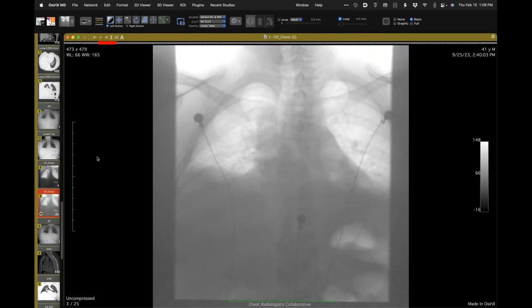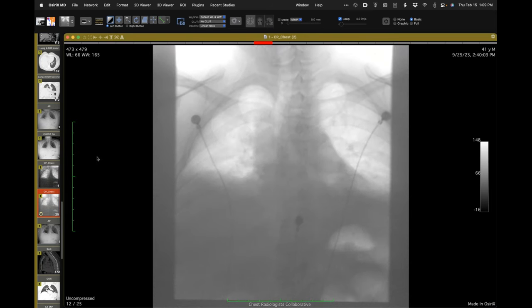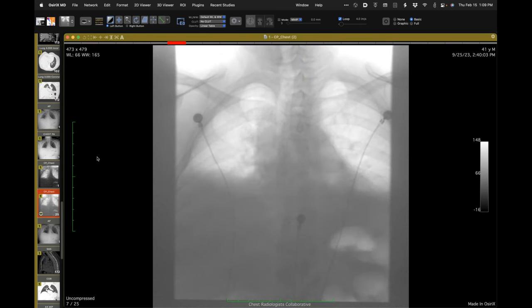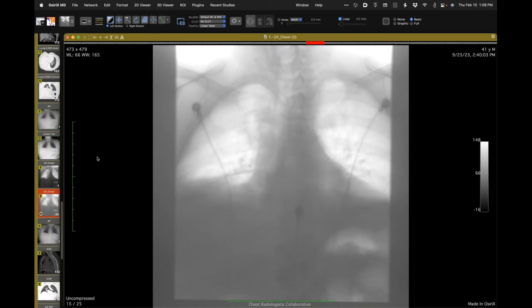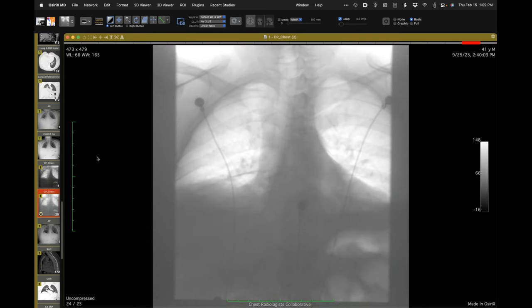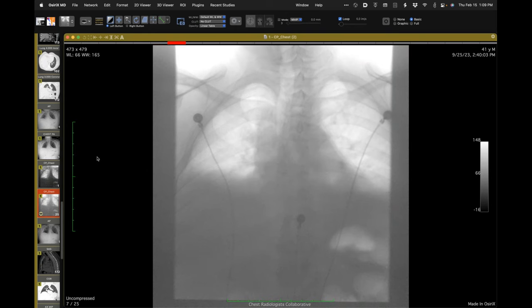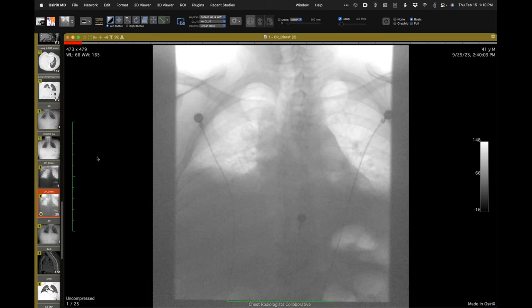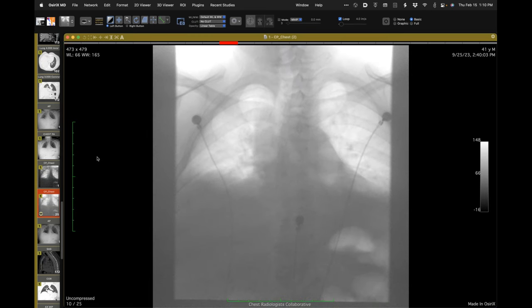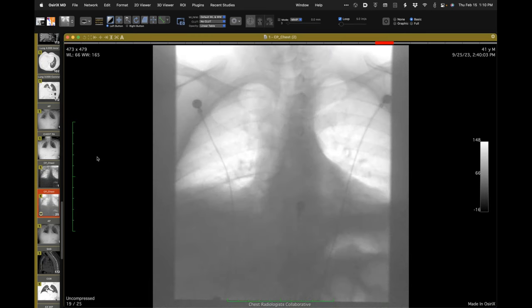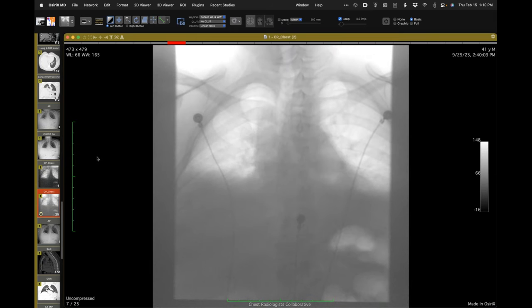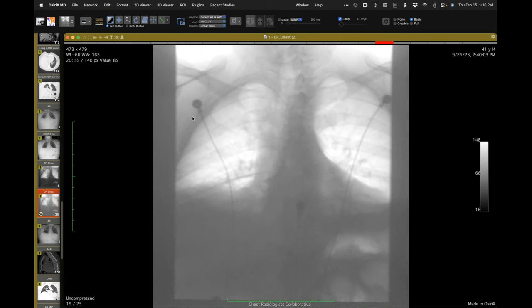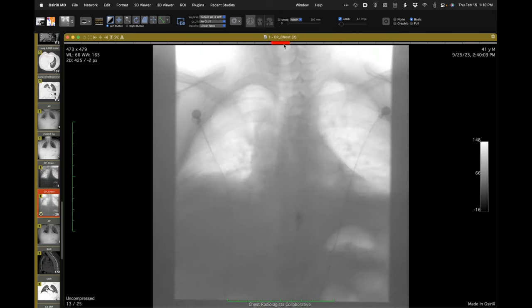I find it very difficult to interpret a series of images from a study I didn't personally perform, because you can't tell what breathing instructions are being used or whether the patient is upright or recumbent. From the point of view of analyzing hemi-diaphragm motion — particularly when the concern is bilateral hemi-diaphragm dysfunction — that's a problem. I don't think these hemi-diaphragms are moving properly.